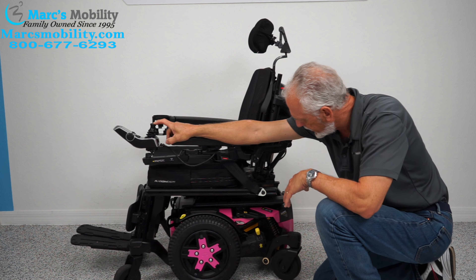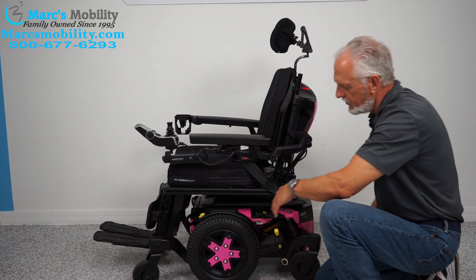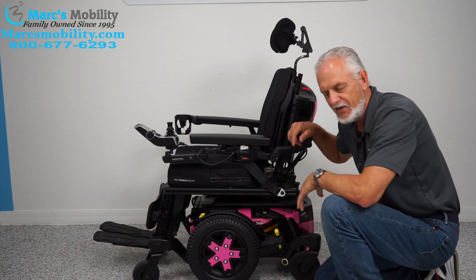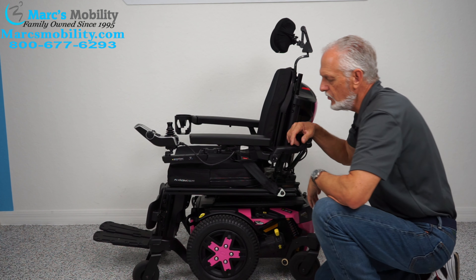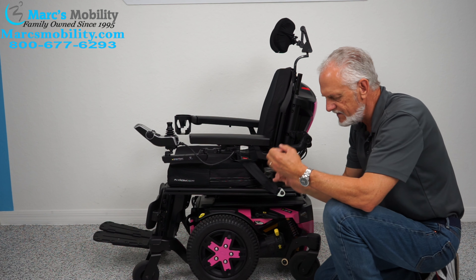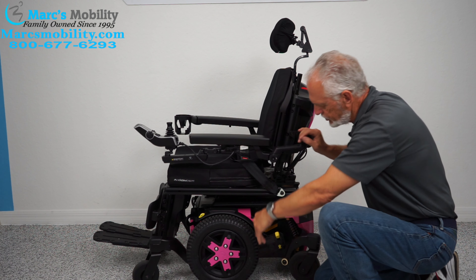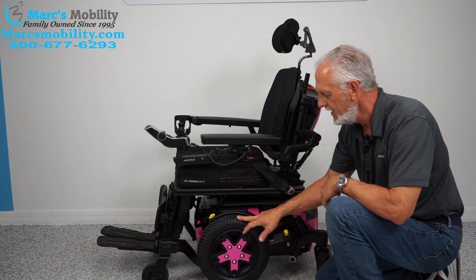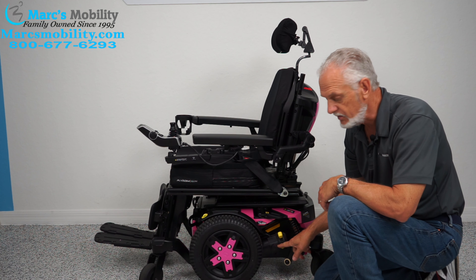You have a motor for each wheel — each wheel has an independent motor. At 375 pounds, it's not going to push easily. But if you turn the power off to remove resistance in the motor, then take this lever and push it down, you can roll the chair with one finger. Now it's in neutral — you have to do both sides, there are two motors, and then you can roll it.